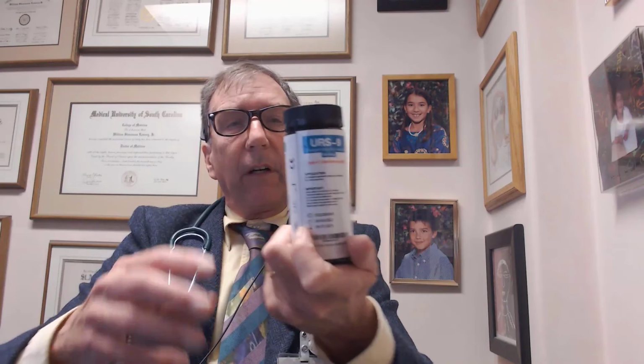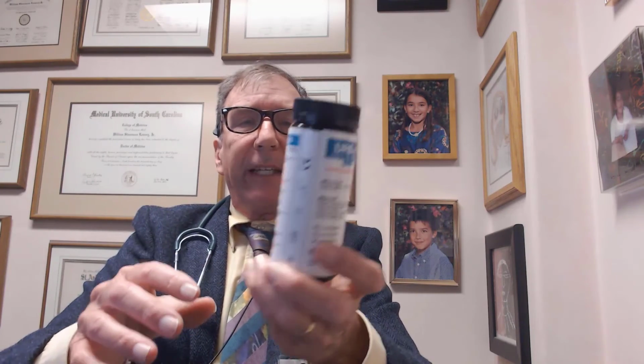Again, there are 100 of these, and then you keep the desiccant in there and keep them away from sunlight. And so that's the way to diagnose urinary tract infections at home. I think I've covered everything.